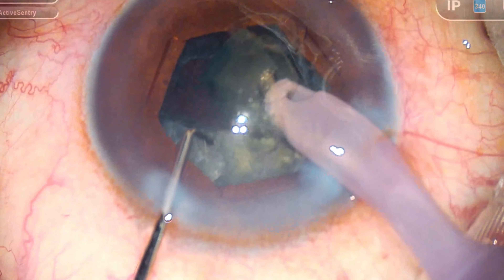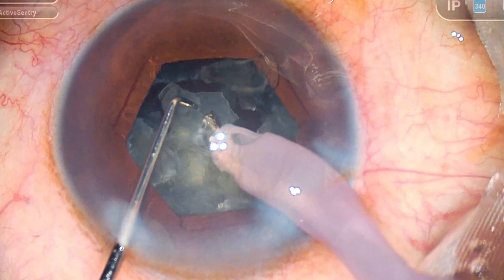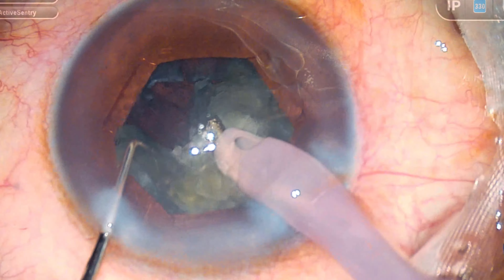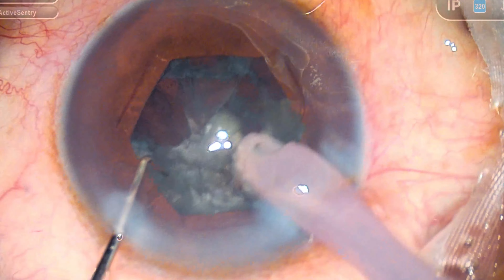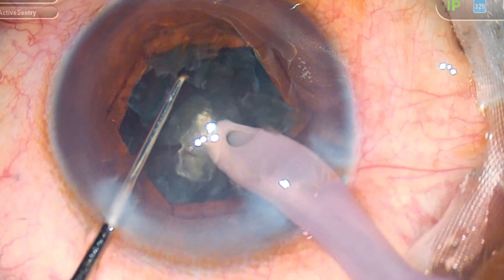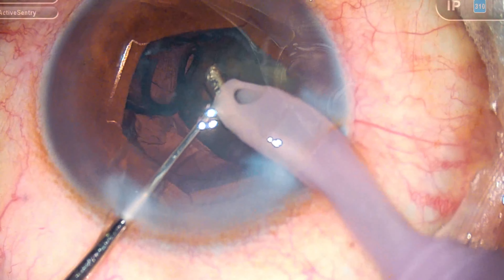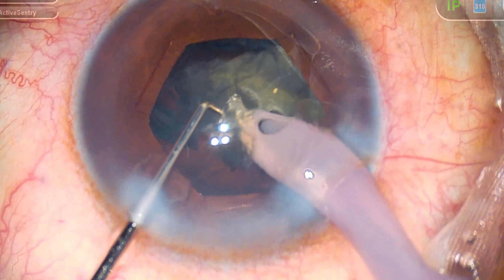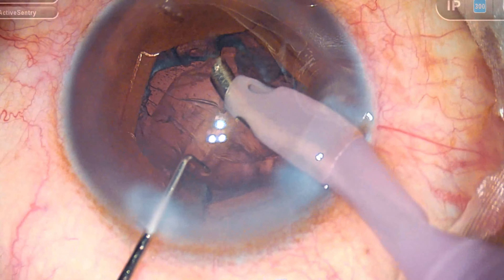If the pieces are stuck together even by tiny fibers, quadrant removal becomes a bit tedious. But once the pieces are free from each other, quadrant removal is very easy — you just need to feed the phaco tip with these pieces. I am using only the torsional phacoenergy here, along with IP (intelligent phaco), which means when there is occlusion there will be delivery of longitudinal pulses, avoiding tip occlusion during torsional phacoenergy. I am using the balance tip with the Centurion phaco machine at an IOP maintained at 46 mmHg, equivalent to roughly 60 cm of bottle height. As we near the last pieces, I keep a watch on posterior capsule fluctuations and reduce vacuum if needed.